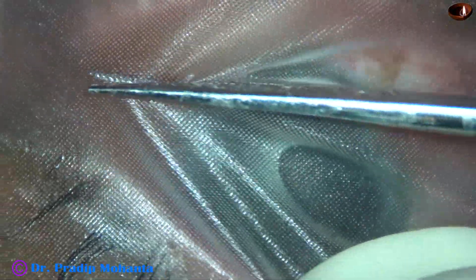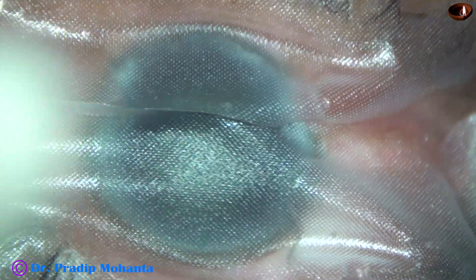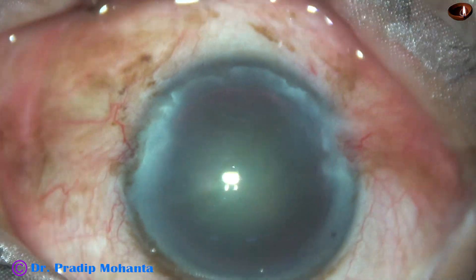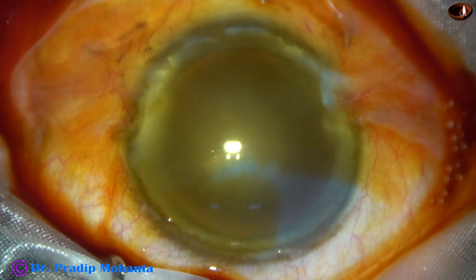The plastic drape is cut from one end to the other end at the middle. I open the plastic drape and my assistant puts three drops of proparacaine. Then I cut the other end of the plastic drape, and a wire speculum is taken and applied to keep the eye open. It is applied in such a way that the lid margins are nicely covered, and at this time three more drops are put after application of the speculum.